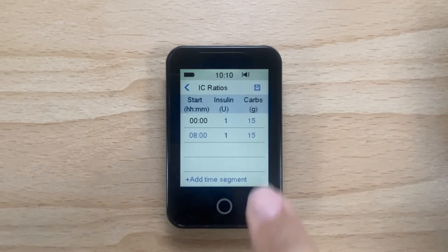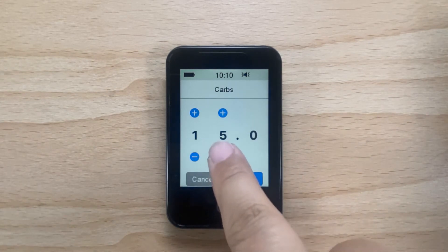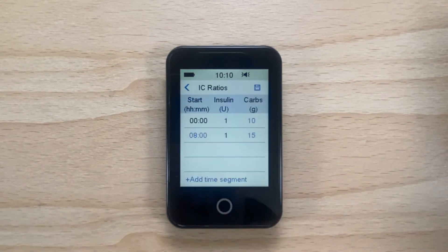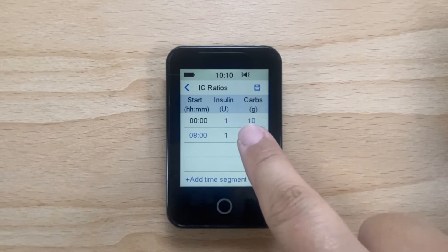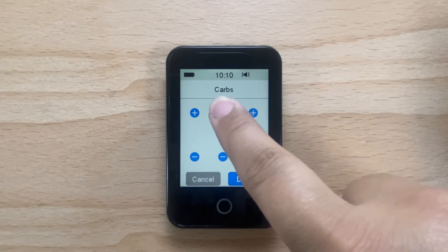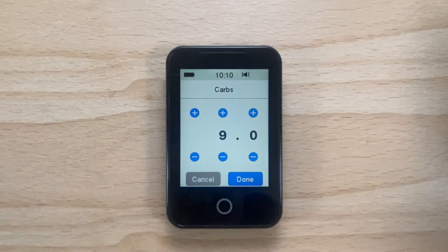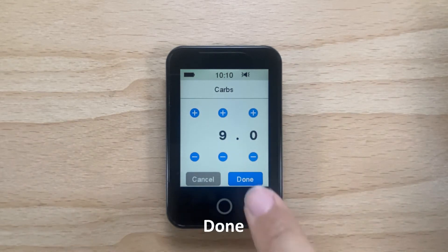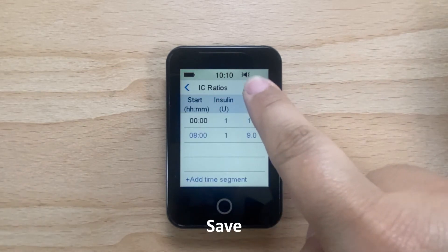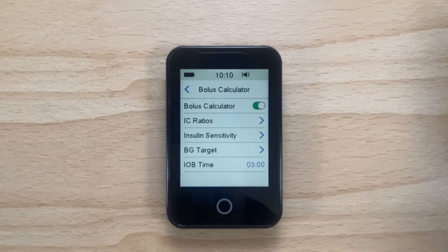You can adjust the ratios for each time segment by tapping on the blue number next to each time segment. Now tap Done. Once you have completed this, tap on the save icon in the top right hand corner of the PDM to save your IC ratios.